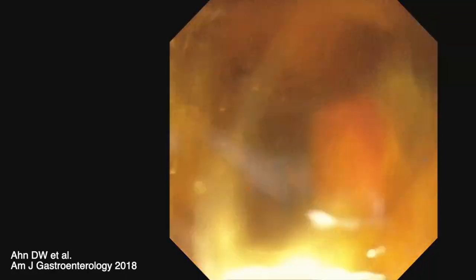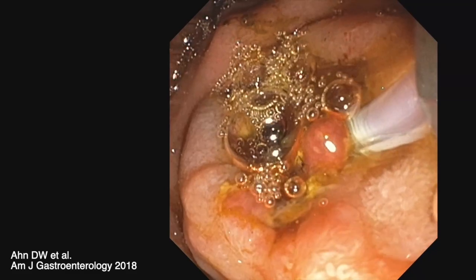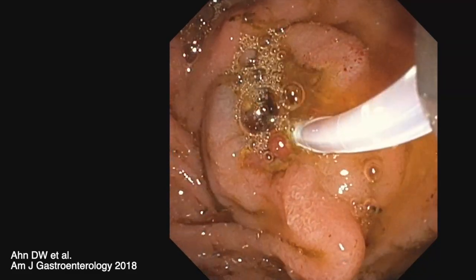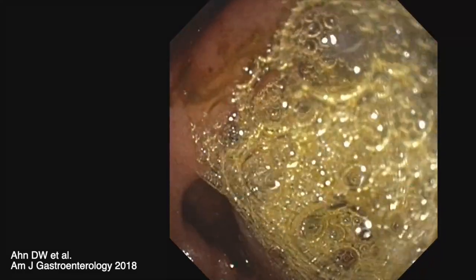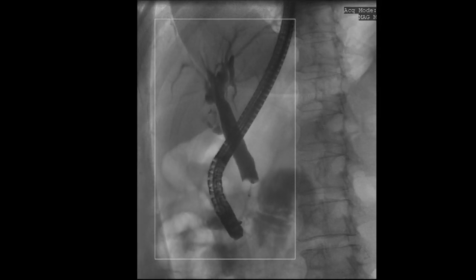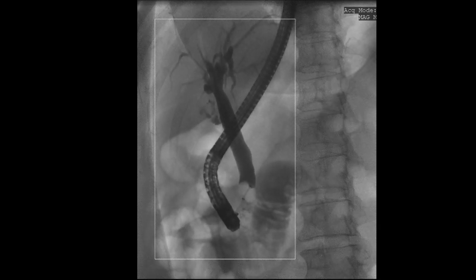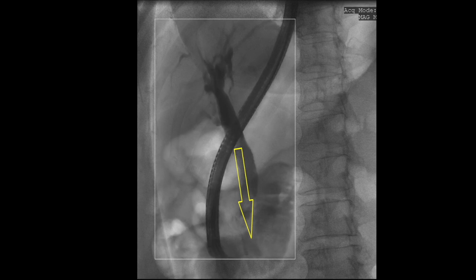The more proximal stones are then removed one after the other. It is also important to irrigate the bile duct with saline to remove any residual debris and to minimise stone recurrence. Finally, an occlusion cholangiogram is obtained to confirm the extraction of all stone fragments. Once again, please note the angle at which the balloon extraction is performed.